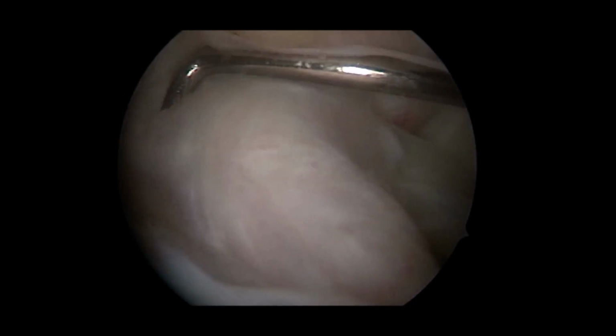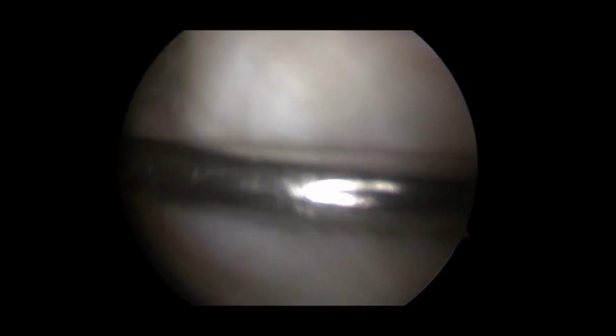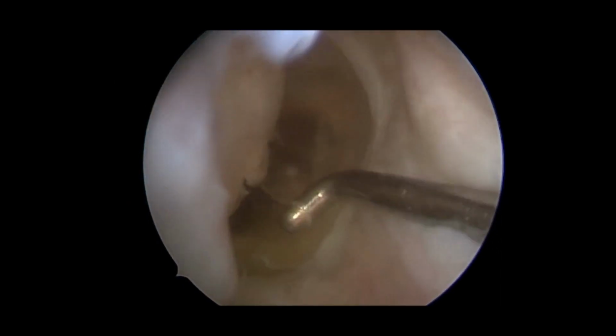Friends, this is the avulsed and torn anterior cruciate ligament lying loose inside the joint, and as you can appreciate, it is detached from its femoral attachment. Friends, this is the place on the lateral femoral condyle where the anterior cruciate ligament should have been attached.